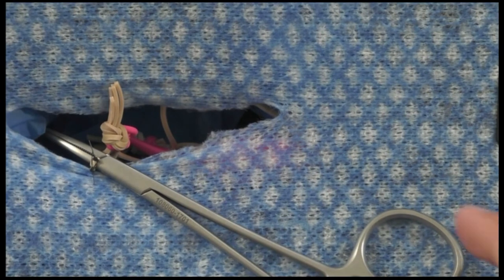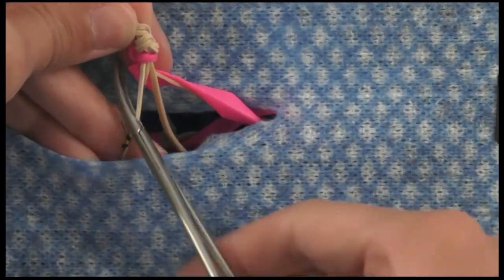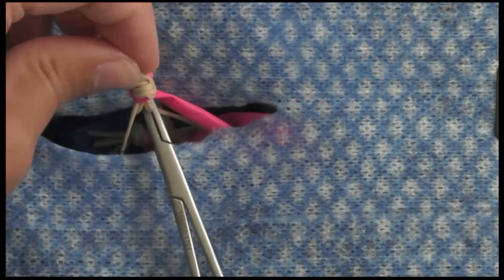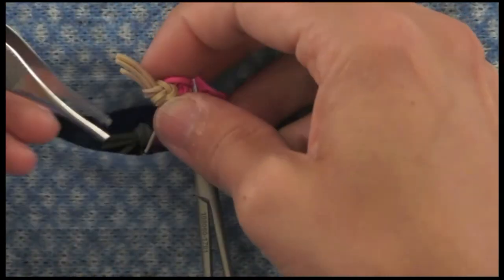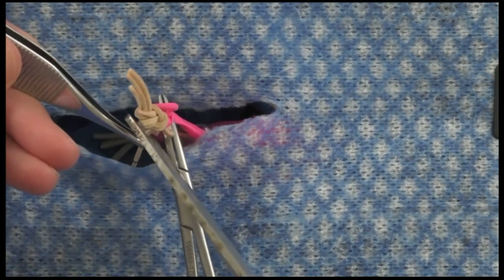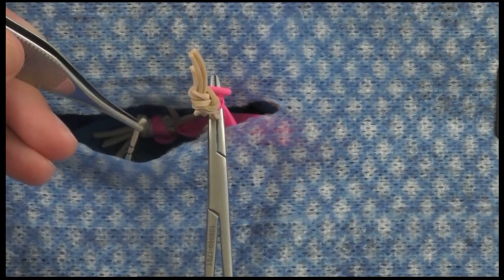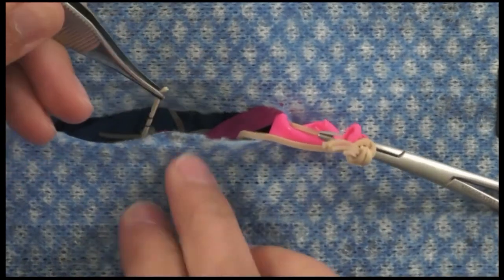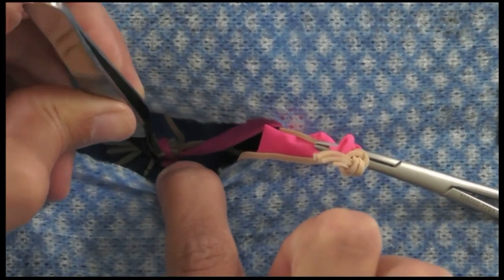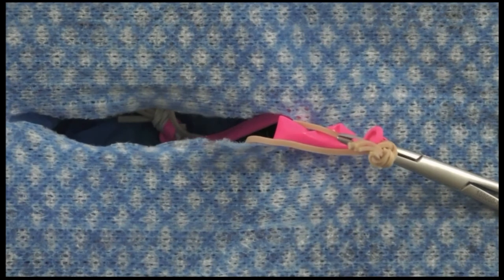Here's a different way of tagging and transecting: reposition your hemostat, tag with your thumb forceps, and cut between the ovary and your thumb forceps. Personally, I find this technique a bit clunky — I prefer using a hemostat — but many people use it either with scissors or a scalpel.